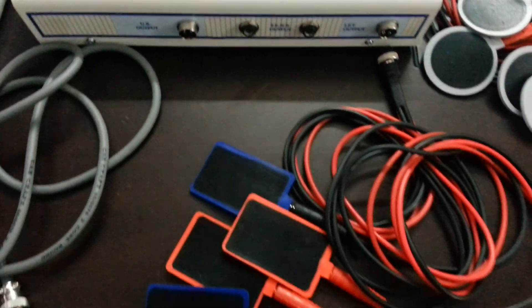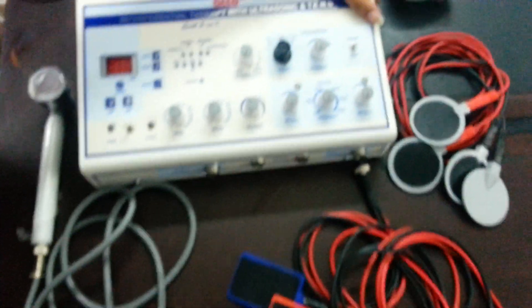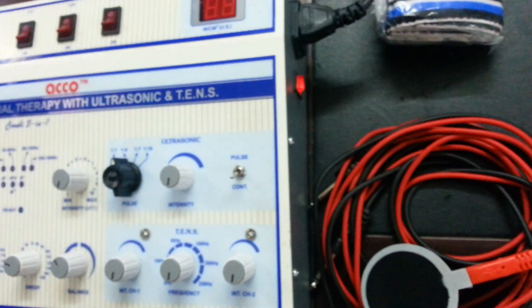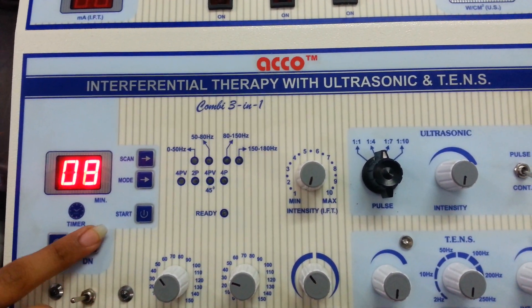Now we will show you the demo of acco Combo of IFT, US and TENS. Switch on the machine. Set the timer as per your requirement. Timer up. Timer down.